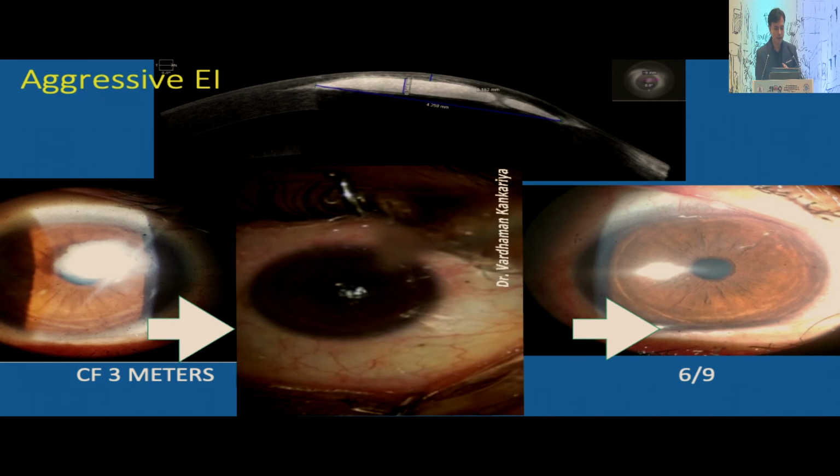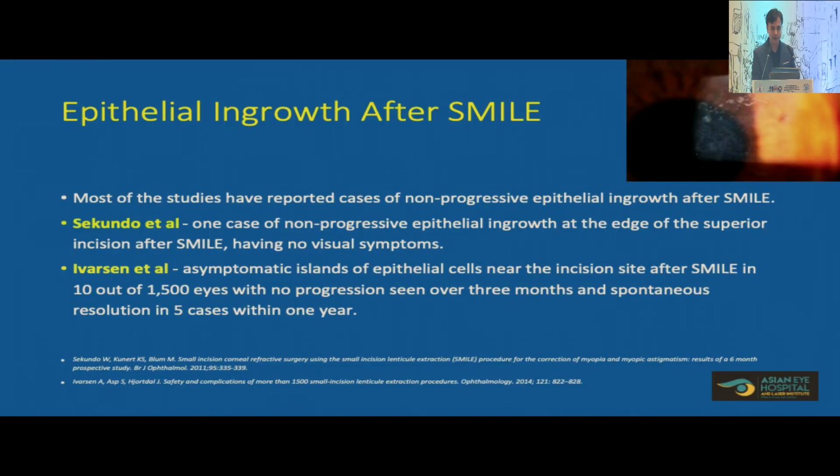So this is the way epithelial ingrowth is generally tackled. Fortunately, most of them are extremely innocuous and we don't have to deal with them. However, compared to LASIK, epithelial ingrowth in SMILE is even rarer because we have a very small cut.